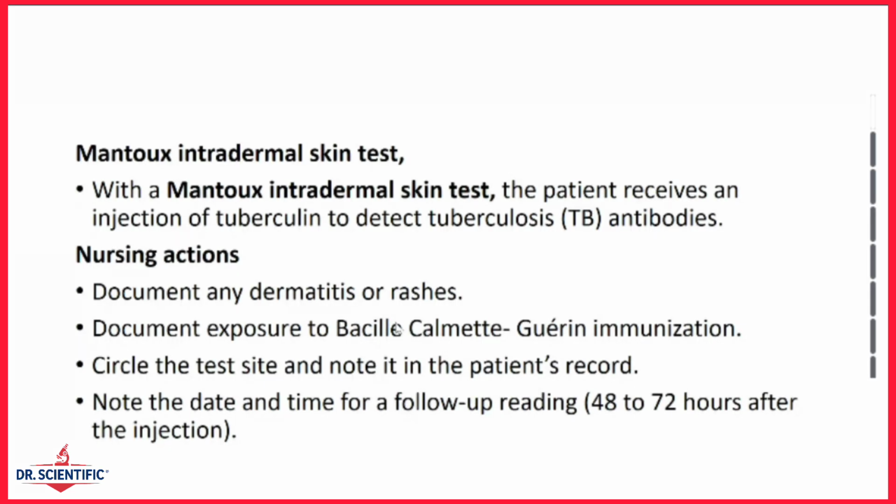Then choose the site of the test and note it in the patient's record. You need to choose a site, and mostly the site that is chosen is a hairless area, so that you are able to clearly monitor the site after the test.